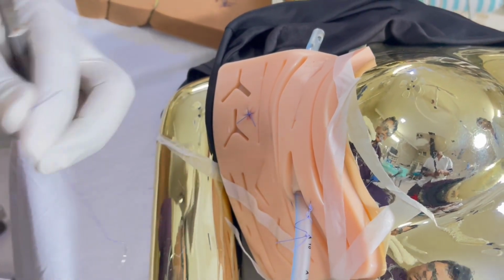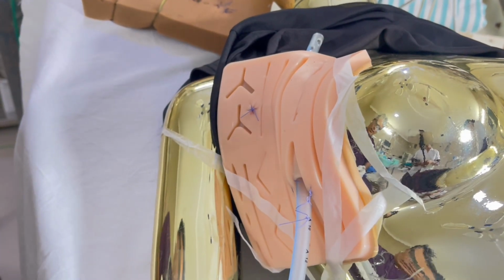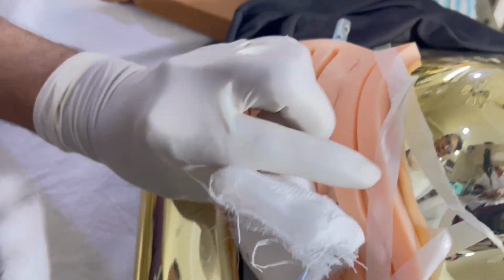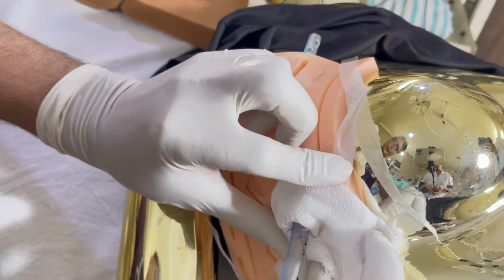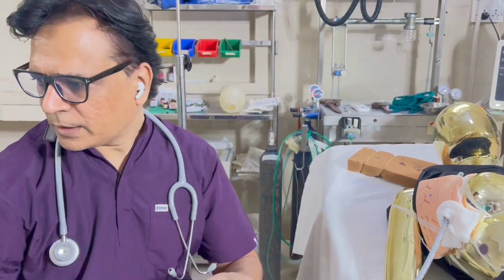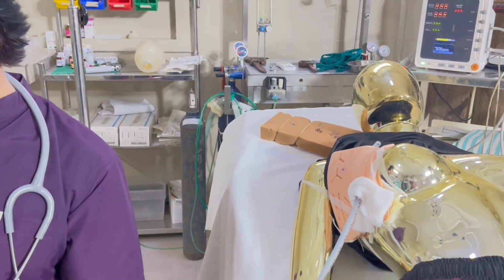And then the method of applying the dressing, when this drain is first of all secured, now you have to apply a dressing. So the dressing is done in such a manner that the drain should not come out. So you put a dressing, simply cut in this manner, and then you put a long dressing. You just remove the sticking and put it, and again the same, this is cut.